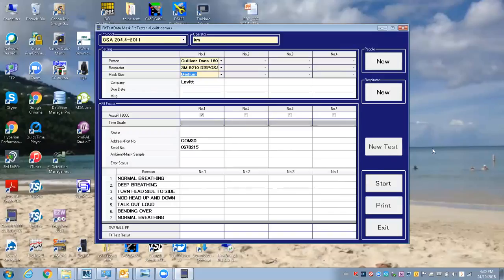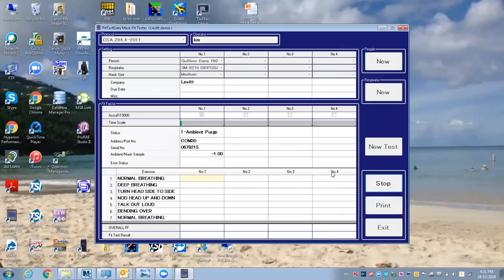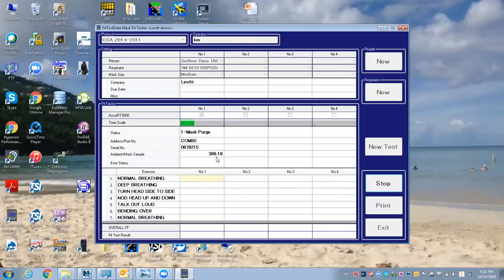Now I could add new people from here, new respirators. If I hit start, you can see it's going through, and you can see this progress bar. It's measuring the background. Now it's switching and starting to measure the mask.